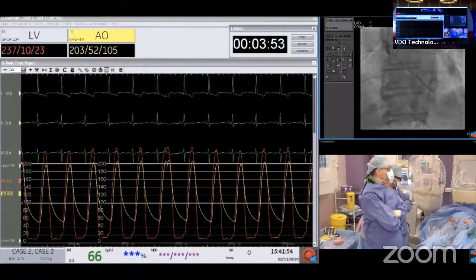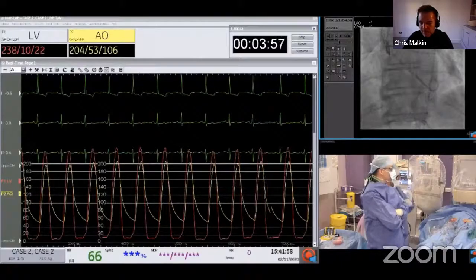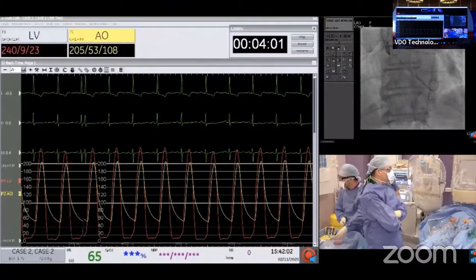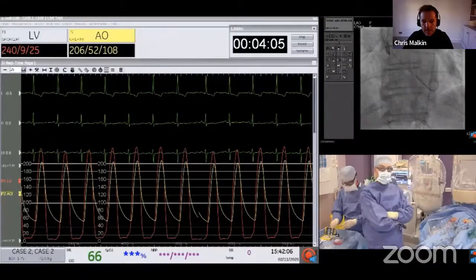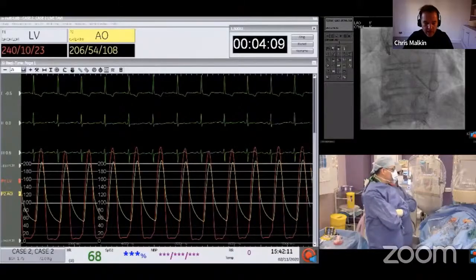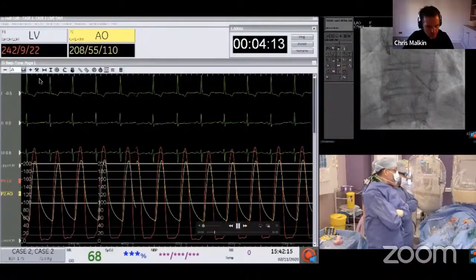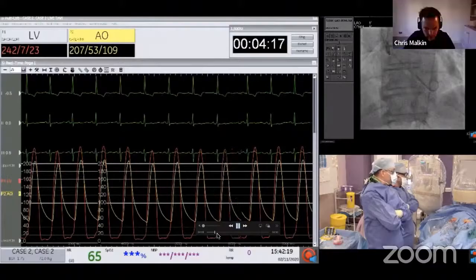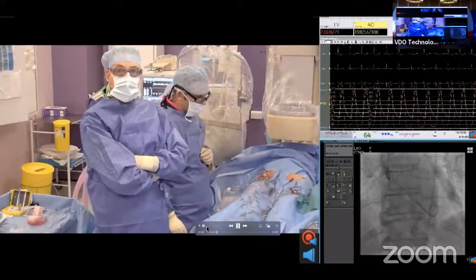You'll also see on the right panel that it's a single groin access. So the 16 French integrated Evolut sheath is in the right leg. In the left leg, there is a needle in the skin that allows us to do LV wire pacing. And we're just talking through the setup views here and just studying the hemodynamics. Now I'm going to wind forward a fraction. I will turn the volume up.